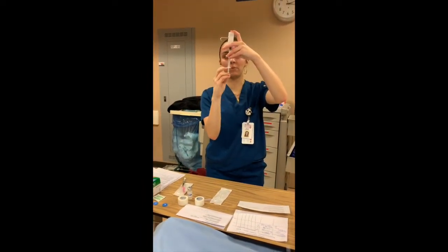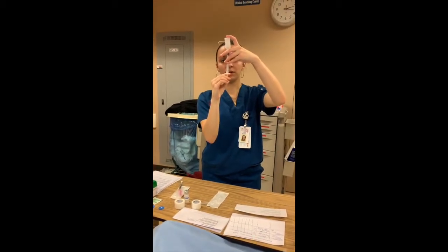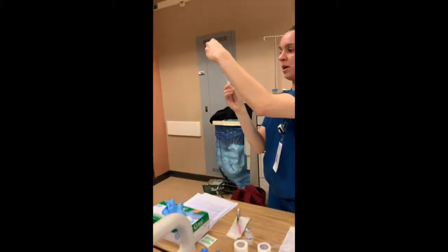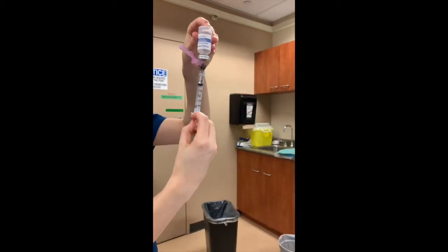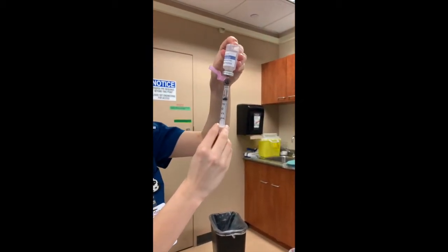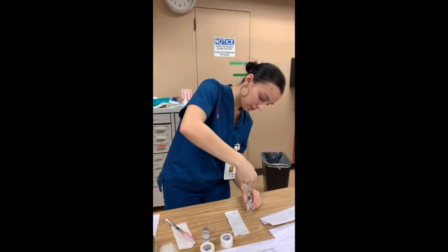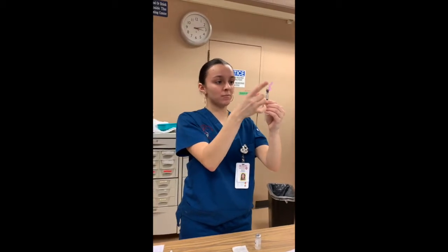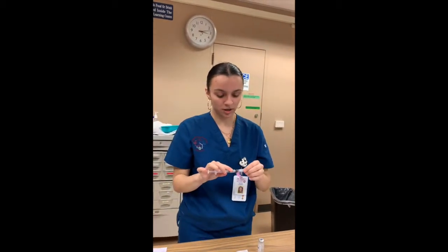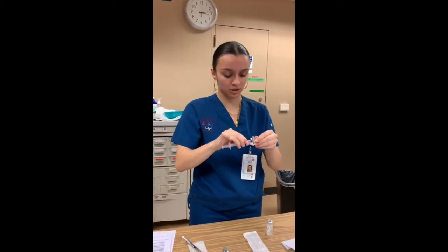I just want to ensure that I'm not getting any air bubbles in here. Okay, so I have the 1 milliliter. I'm just going to draw just a little more, just to push out all the air bubbles and if there's any leakage. So I'm just going to get a little bit more. Okay, I'm going to pull it out, and I just want to flick it just to get any slight air bubbles out. So after I do this, just for safety and precautions, I'm just going to put the cap on, and then I can get started on my subcutaneous injection.